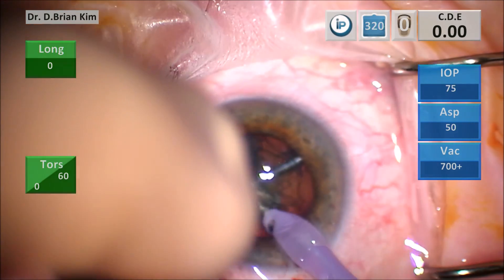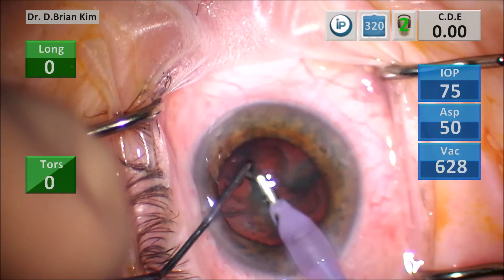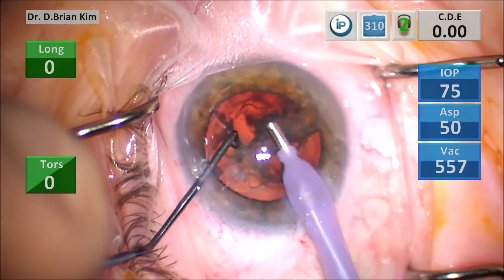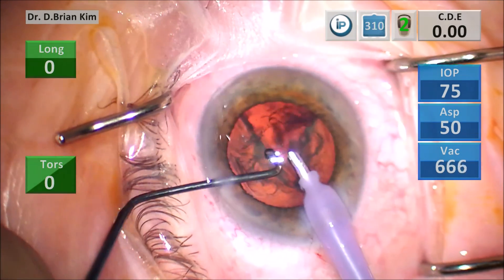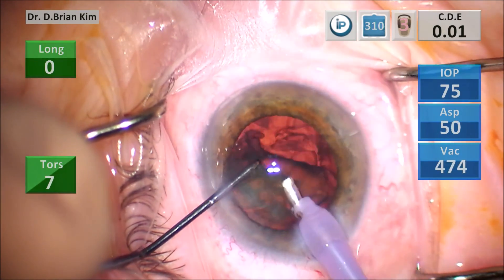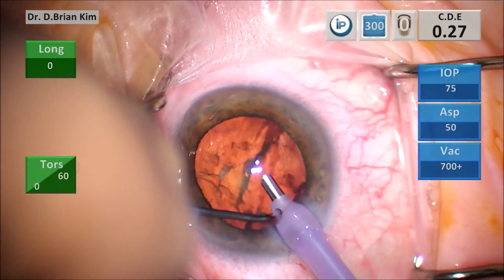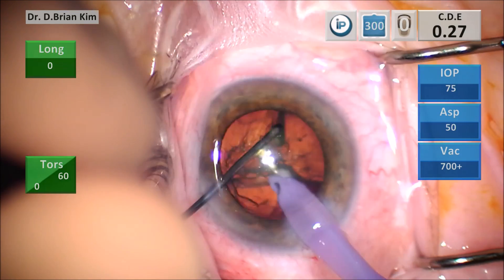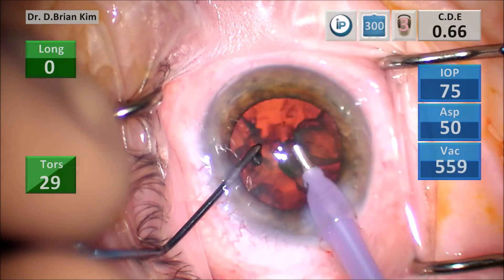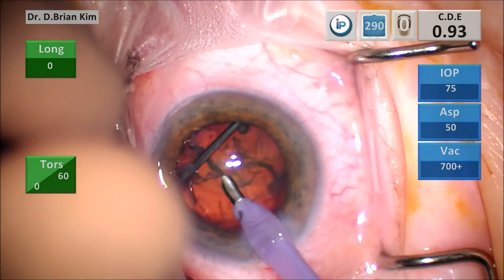In summary, the chop maneuver involves keeping the wrist pronated so that the chopper tip is facing out into the periphery, pushing down a little bit into the epinuclear material and as you slide out past the anterior capsule, you supinate your wrist so that the chopper then faces the phaco tip — this is the ready position to initiate the chop. You place the phaco tip bevel down, sub-incisionally, into the epinuclear material but outside the level of the endonucleus, then bring the two instruments together and chop.